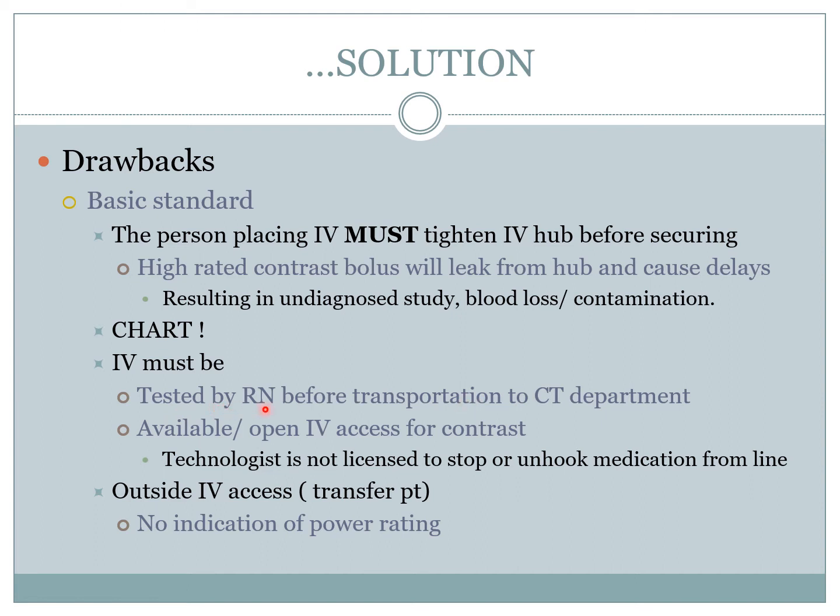And once they're transported all the way to the CT department, the IV is already bad. And guess what? They need to be transported back to the room. So it's best to just check while they're in the room. If it's still working, let them go to the CT department. If it's not working, then put in a new one, and then they can come to the CT department.